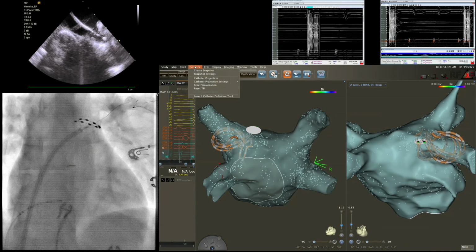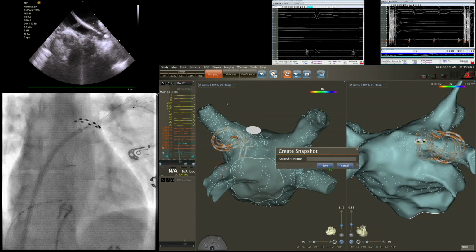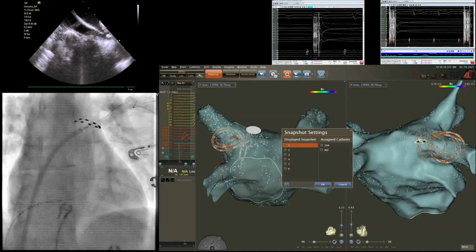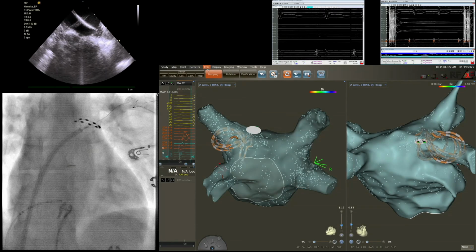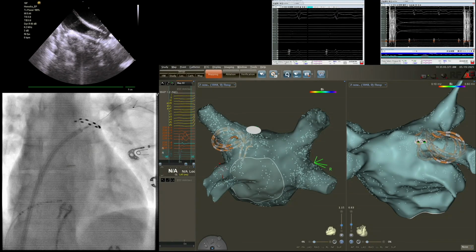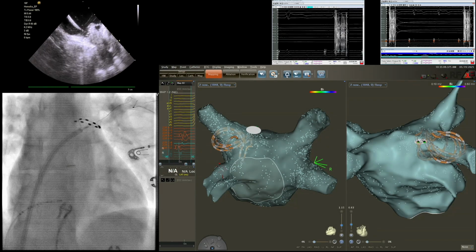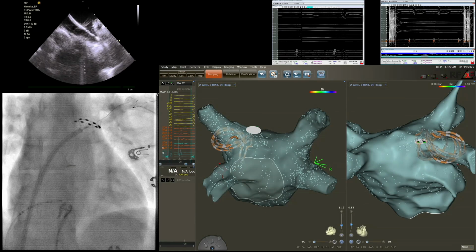And let's move to left inferior then. Go pulsing. Actually, I don't care about the duration of the procedure. Now we are really trained to be fast, but I still don't want to see the patient a second time or third time on the table, which is devastating our workflow.